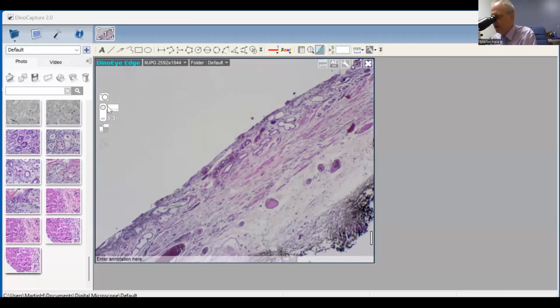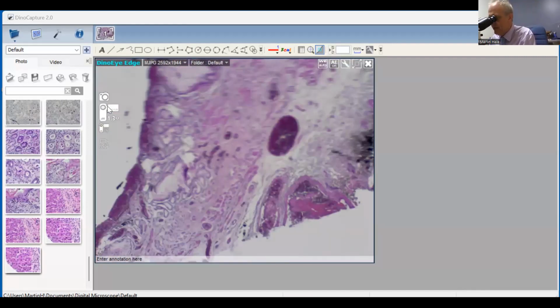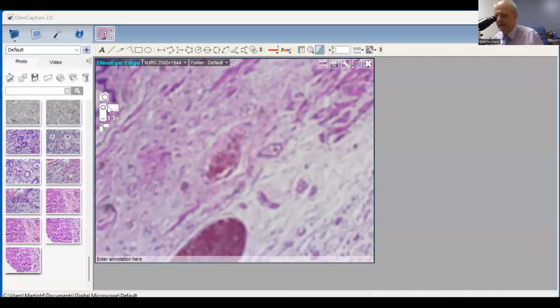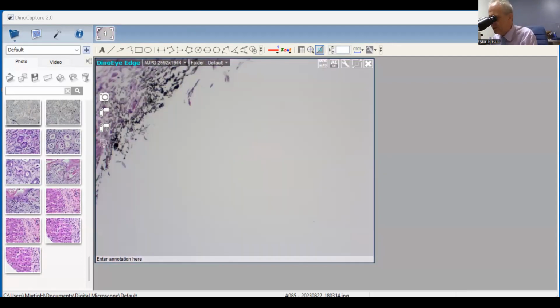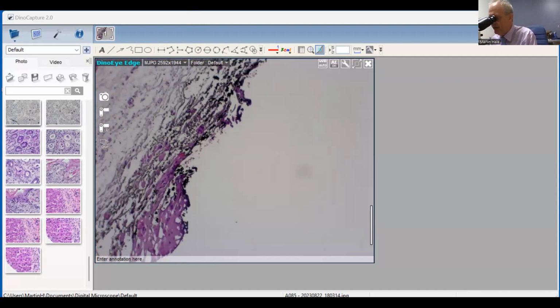So what I've got here is I could tell you exactly where I am. Now on the mucosal surface, I said there was red ink, and there is the red ink. So that is the resection margin at that end. And then this is the black ink, which tells me the deep resection margin there. So I know exactly where I am.